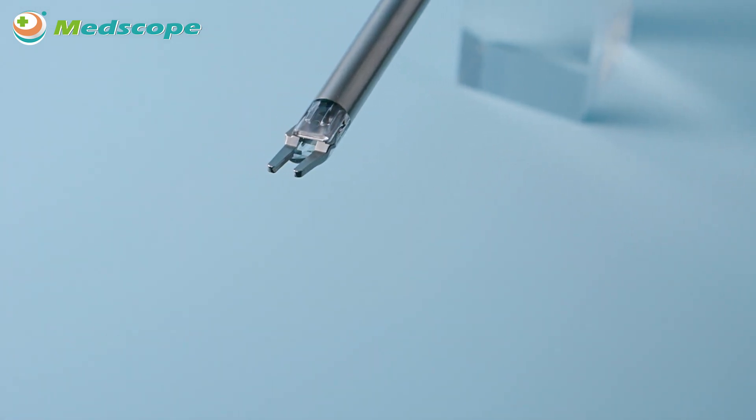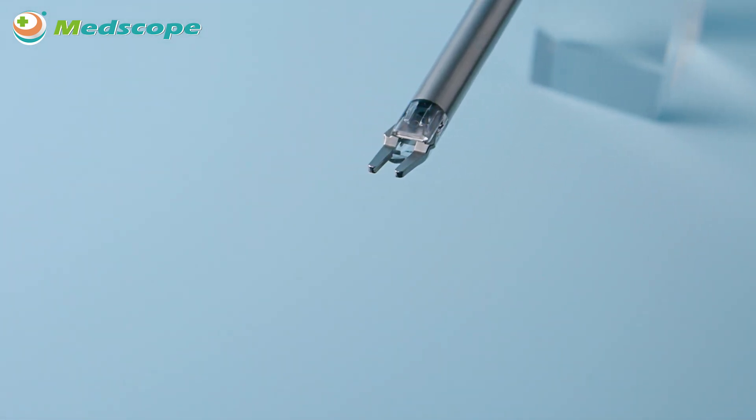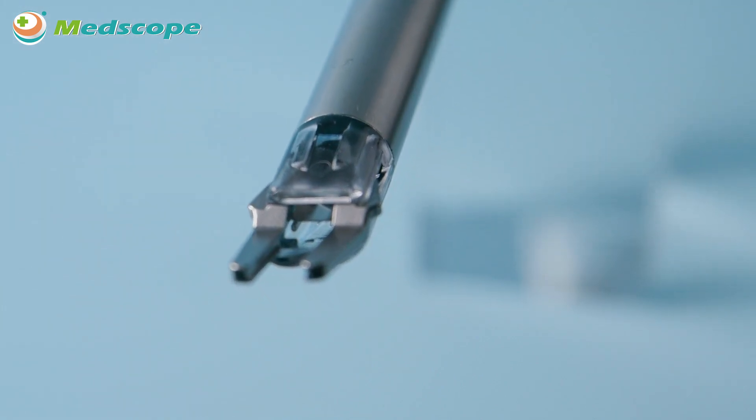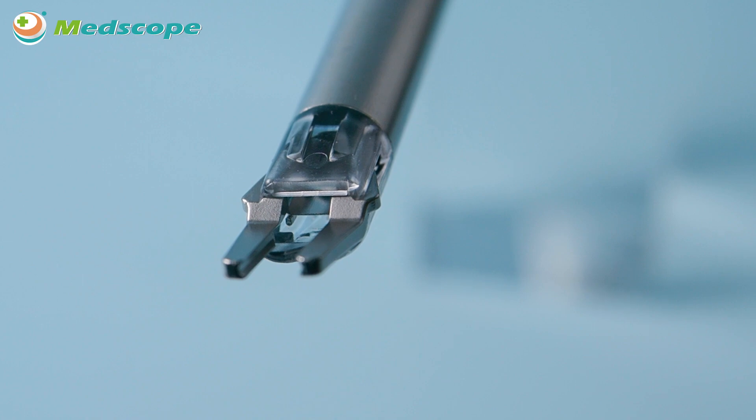Advantage 3: Optimized Clip Closure Design. Our special jaw design and clip loading system effectively stabilize the clip during operation and minimizes the possibility of scissored or twisted clip.